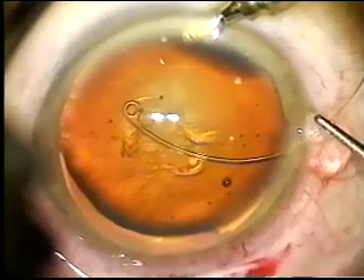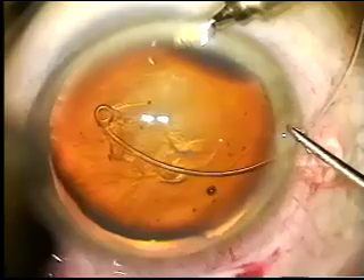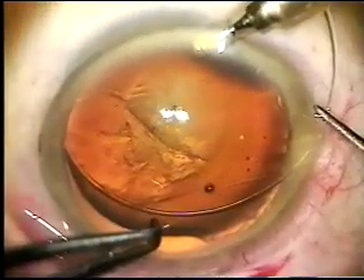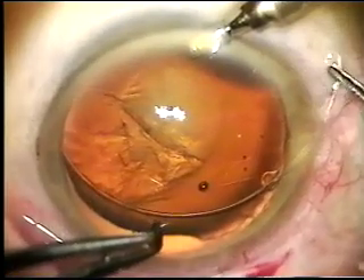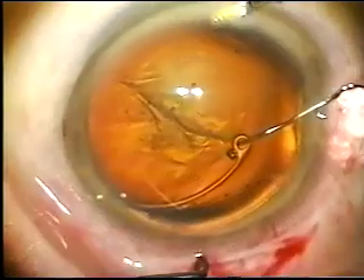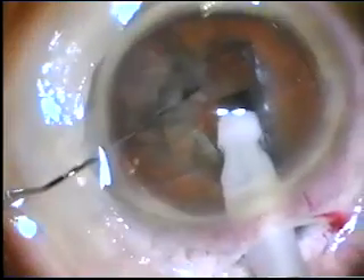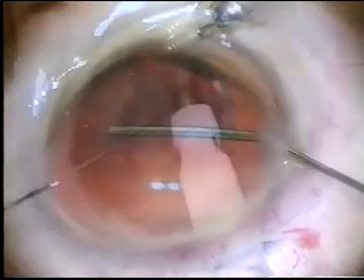Note that the ring is being placed before phacoemulsification to stabilize the capsular bag and to prevent any further zonular dehiscence from the stress of surgery. When the loop is entirely within the capsular bag, the lens is again centered and phacoemulsification can proceed without difficulty.